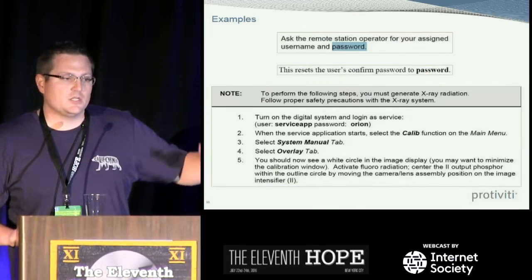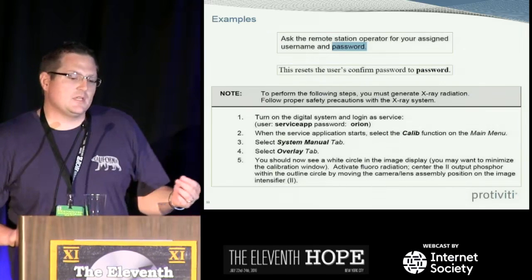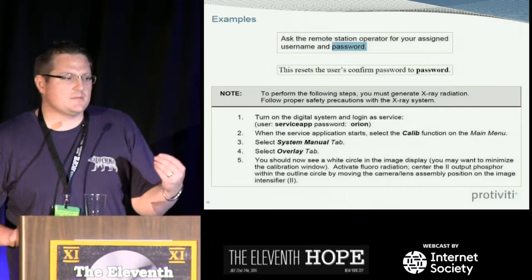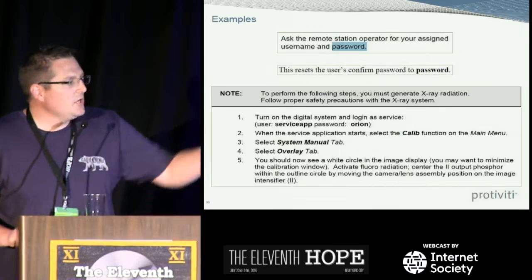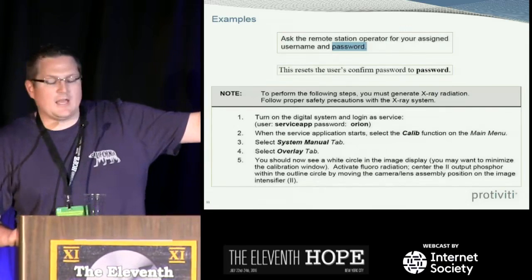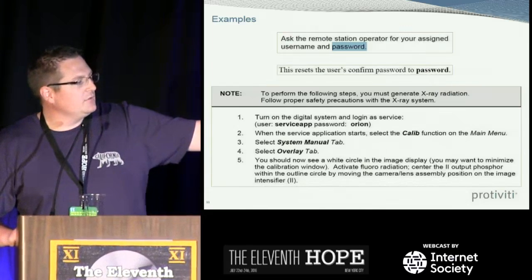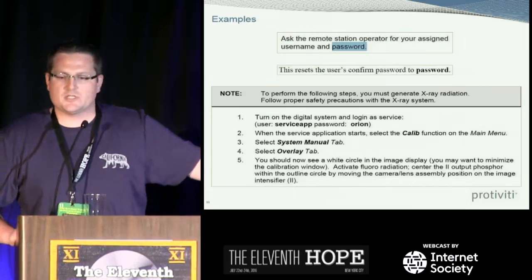So we know radiation is going to get emitted, right? And with those types of things, there are dosing limits and also exposure time limits, those types of things that could cause harm. And so we know if we run this, it's calibration, so it's probably not high-level radiation, right? It's just log in. Here, simple username and password, do this and you'll run radiation.